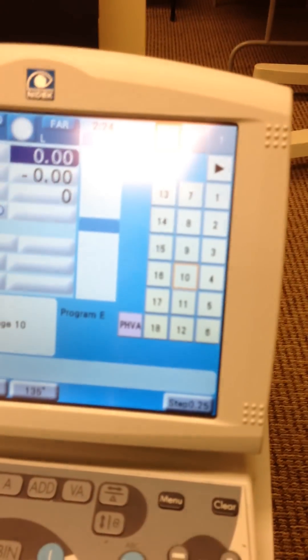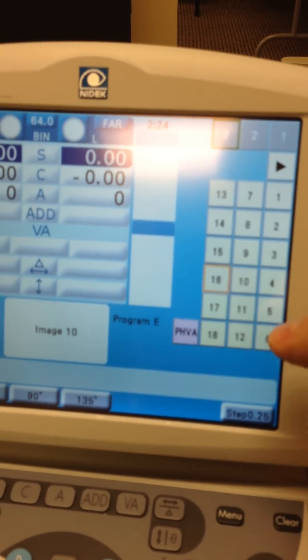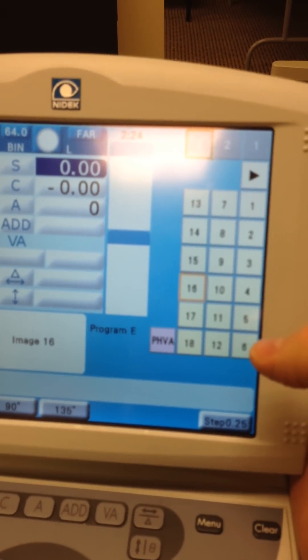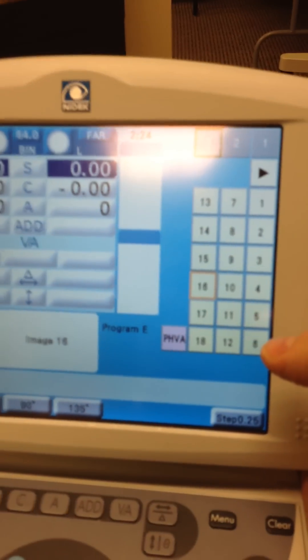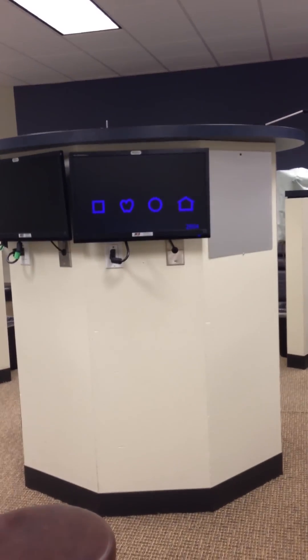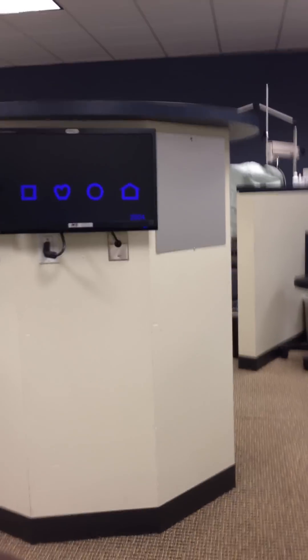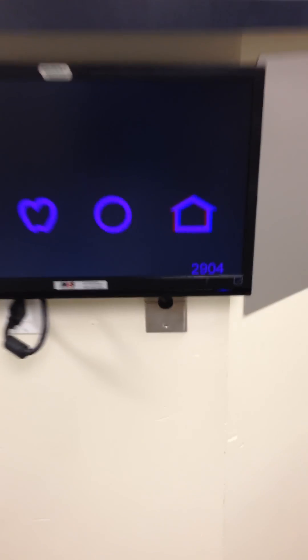But what we really want to know is contrast and depth perception. Let's do Lea Stereo first. Number 16 from the panel will take it to Lea Stereo. This uses red and blue anaglyph, and if you look carefully at it, you'll see there's a number down in the corner.